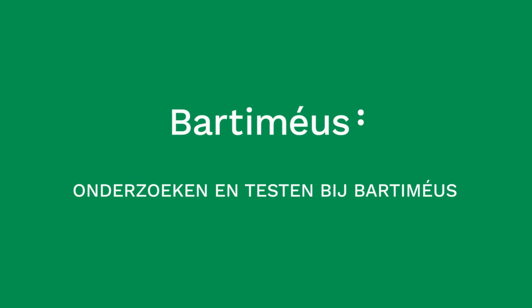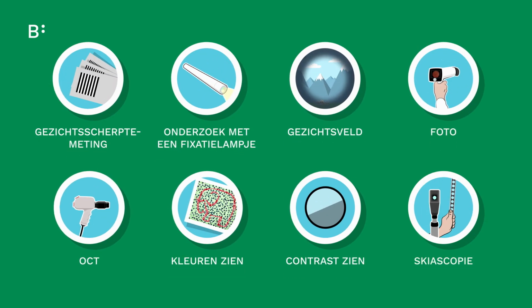Research and Testing at Bartimeus. Welcome to Bartimeus. To monitor the condition of a child's vision and to detect possible problems, we conduct a series of tests and we observe and analyse the child's visual behaviour.